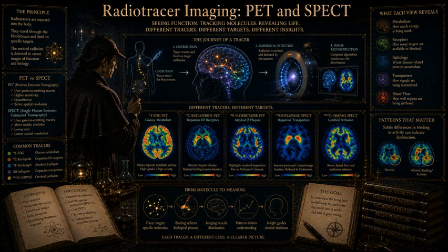You are manufacturing radioactive isotopes on demand. You fire protons at a target gas to create the carbon-11, then you pipe that radioactive gas directly into a hot cell, which is a heavily shielded robotic chemistry lab.